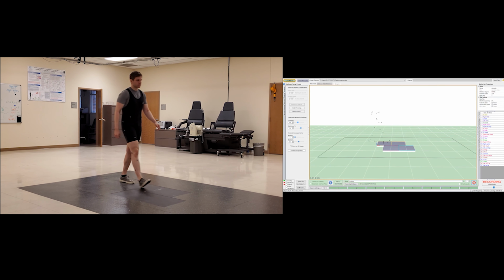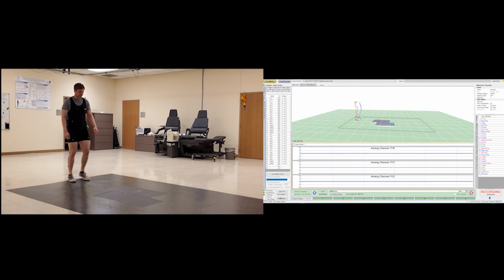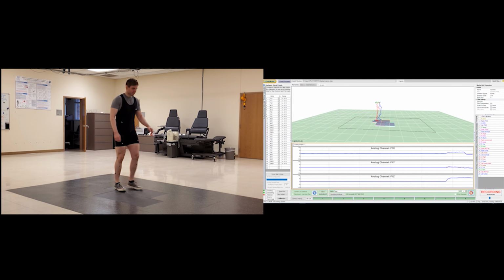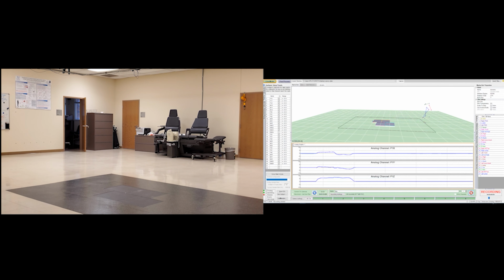We just compare it against healthy control data, and any sort of discrepancy is reason to theorize that some sort of neurological effects are occurring that might be delaying it or altering it in some sort of negative way.